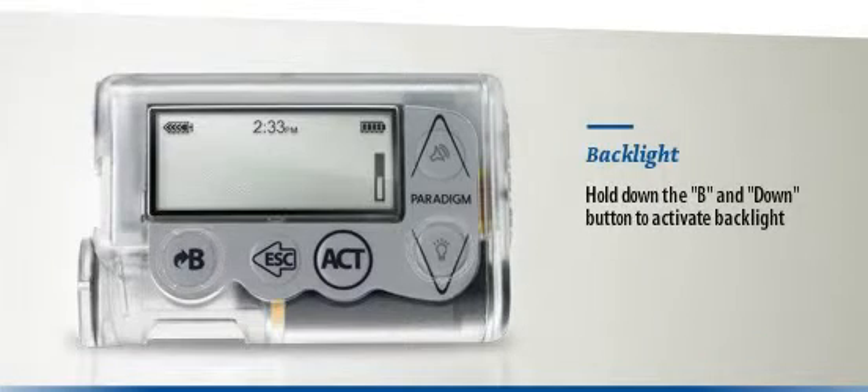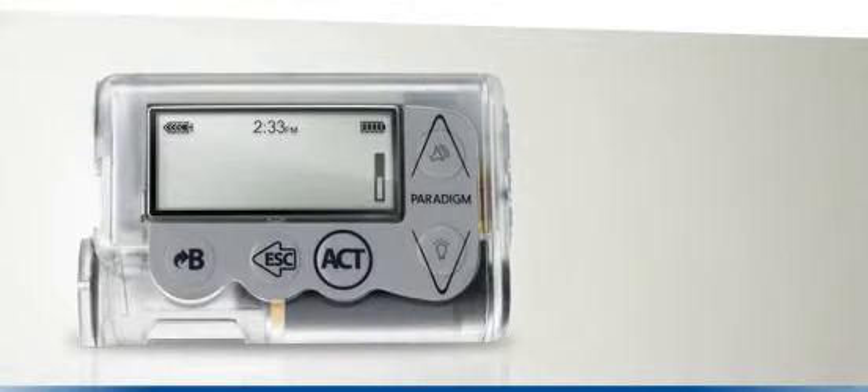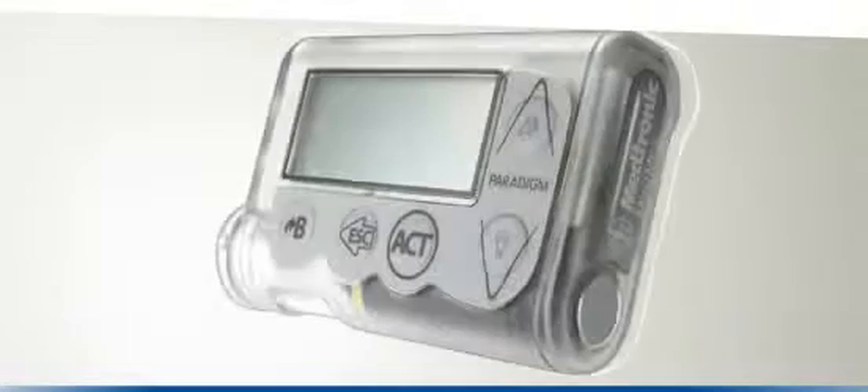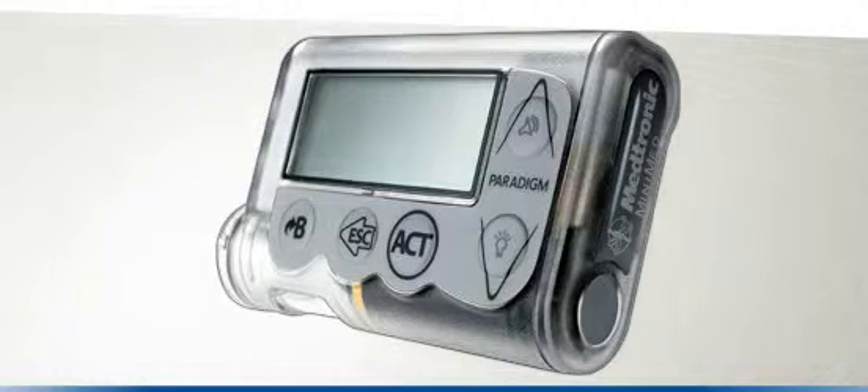Try to familiarise yourself with these buttons now, as we will be referring to them throughout the instruction video. Let's find out a little more about the menu screens on the Paradigm Veo and how you can navigate through them.